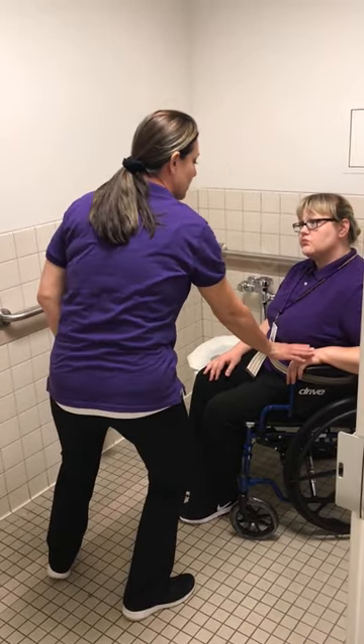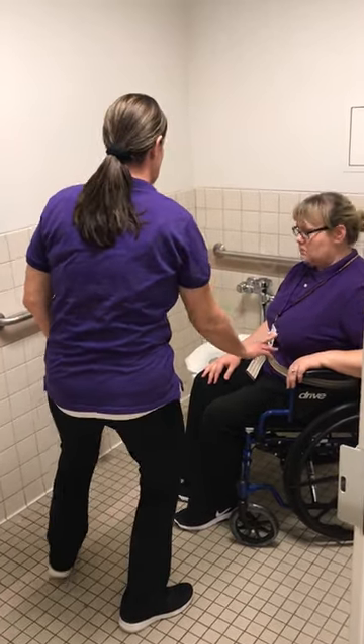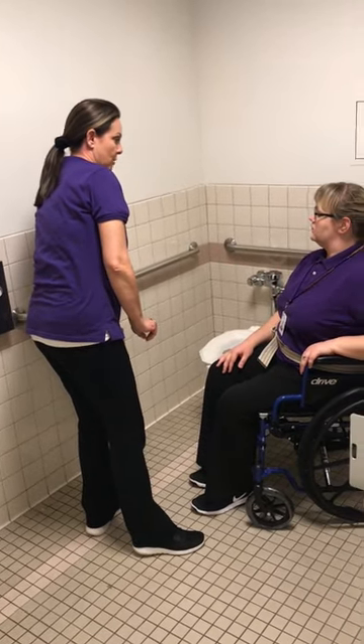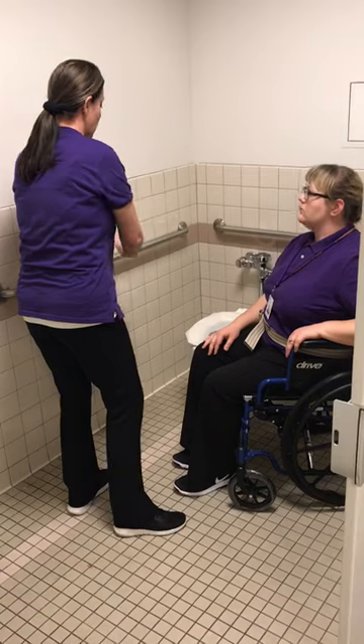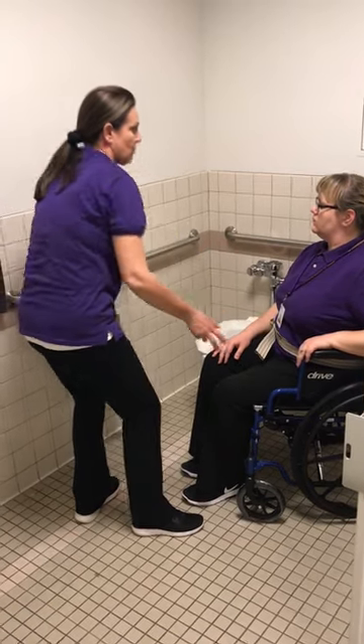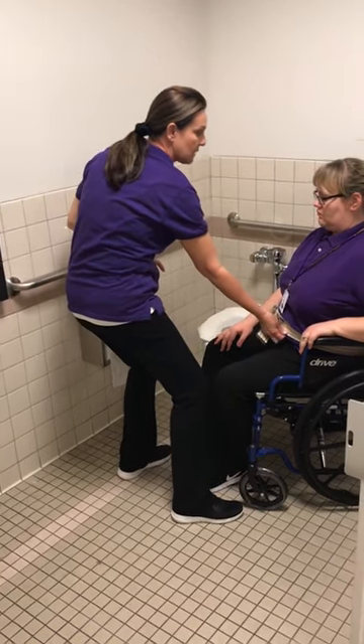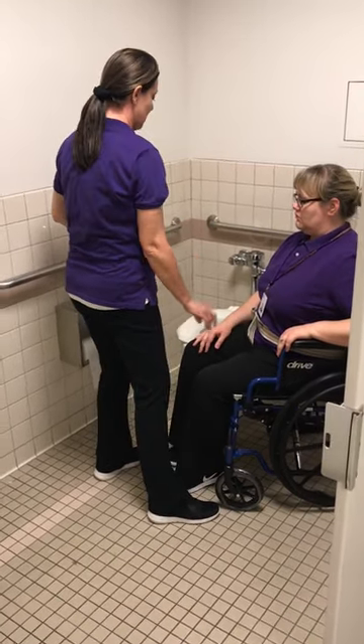All we're going to do is use this left armrest. So with your left arm, you're going to transfer, and you're going to reach out with your right arm and hold onto the grab bar. Those are going to be your two stabilizing points. I'm going to count — one, two, three — and I'm going to help with the assist of the gait belt here. That's also another safety measure, and we'll get you onto the toilet.